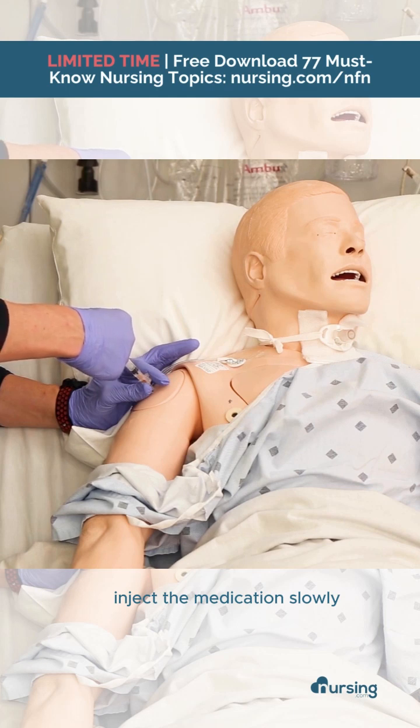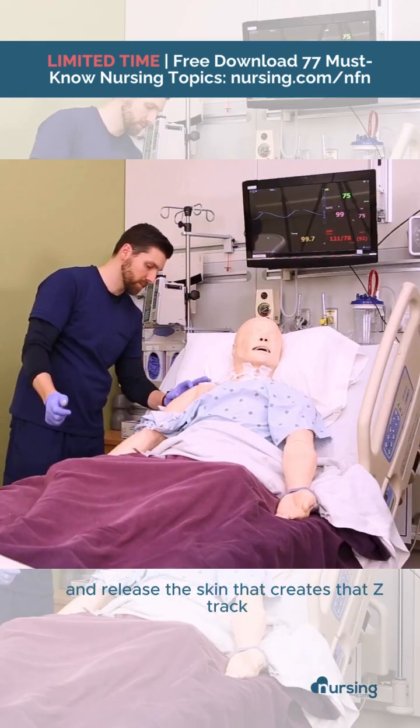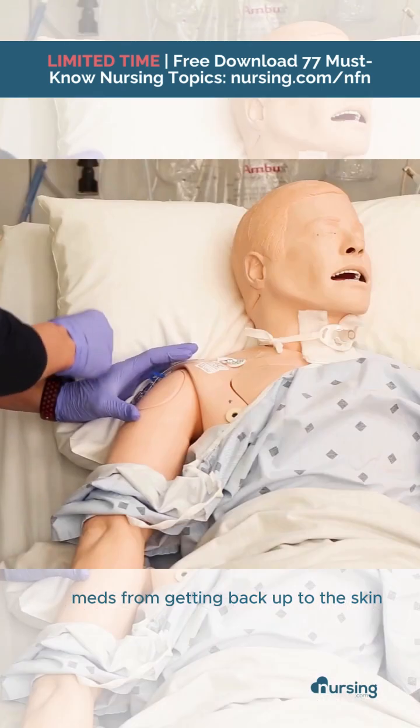Inject the medication slowly. Then remove the needle and release the skin. That creates the Z-Track to prevent any irritant medications from getting back up to the skin.